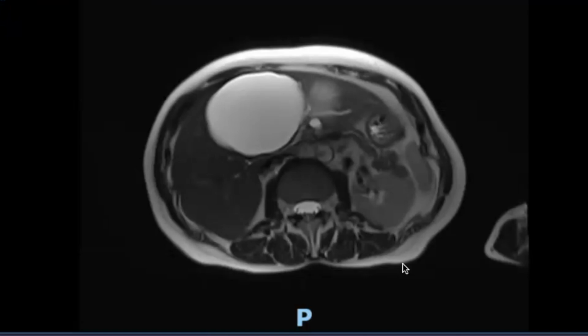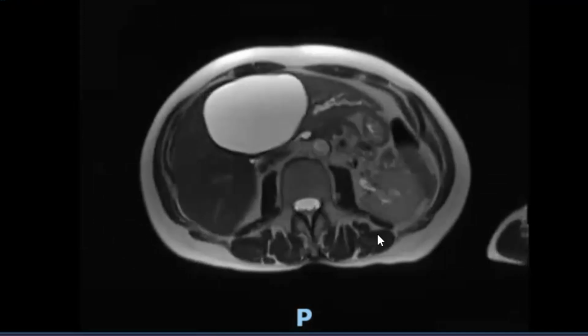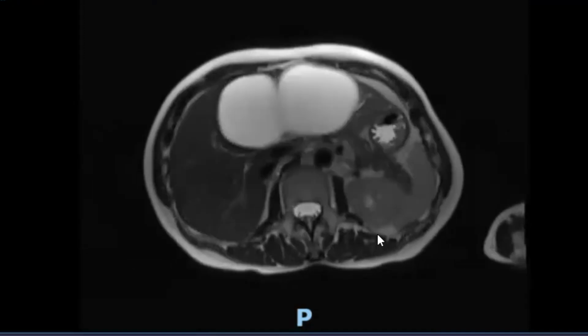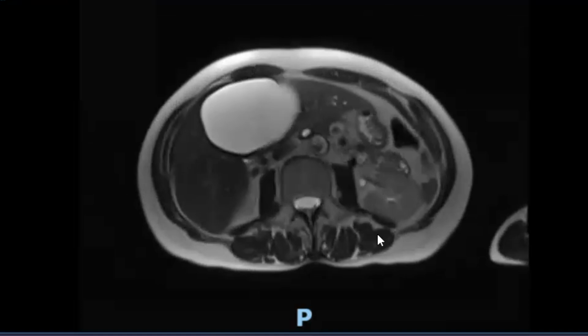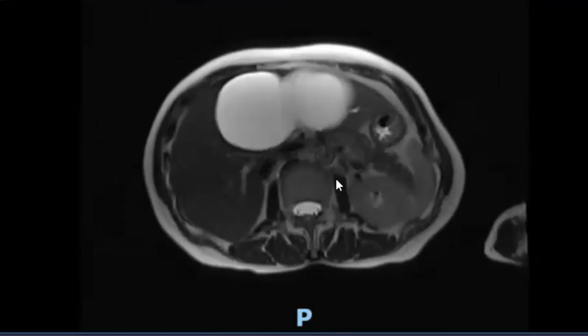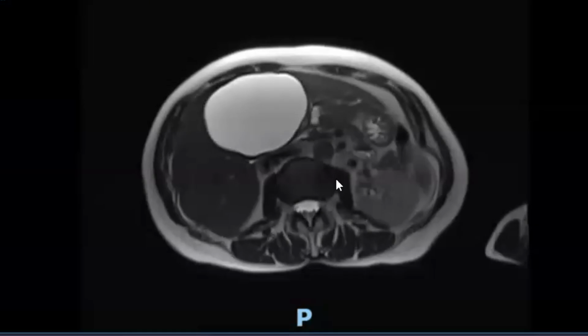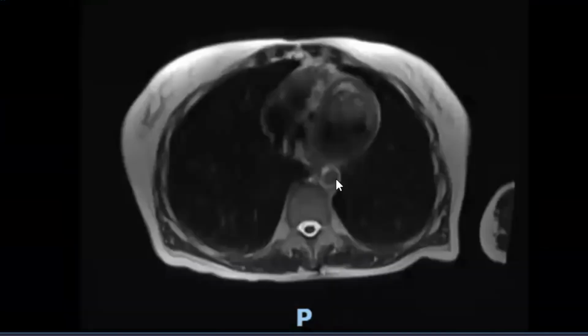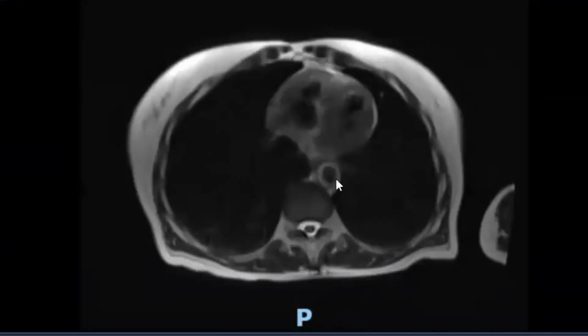A cholangiogram or an MRI, cholangio MRI? The MRI is the best, in fact, the best way to see them is this one, because otherwise on the cholangiogram, on the reconstructions, you see the cyst and you see virtually nothing else. But is there a connection between the bile duct and the cyst? No, absolutely not.